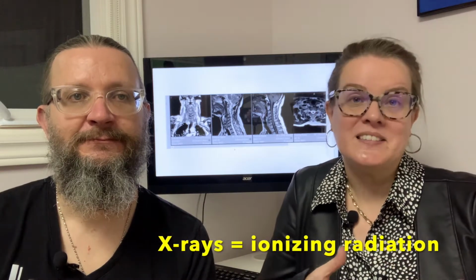Now, X-rays come from ionizing radiation, exposure to ionizing radiation. And we have an image receptor behind you, so it exposes it onto that receptor, and then we have the image from that. And it'll show mainly bone, so bony tissue, because just the way we calibrate it, that's what we want to see.